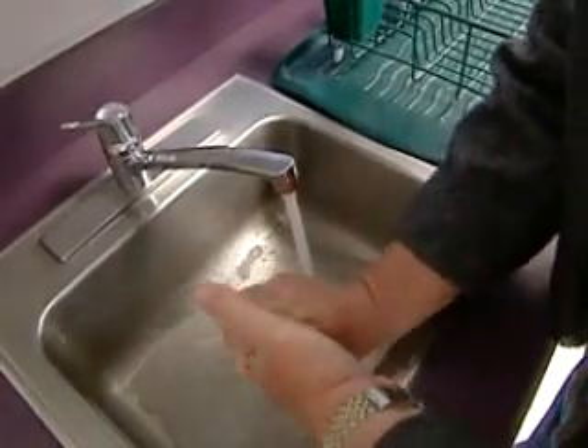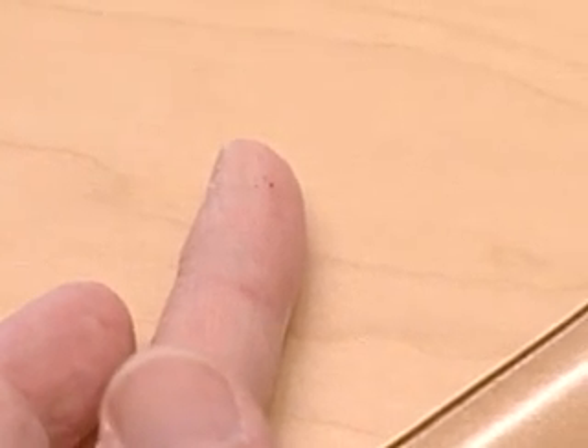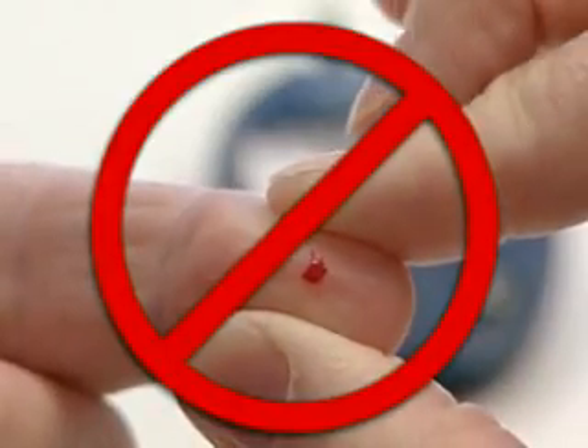Once you're ready to test, wash your hands because even a little bit of food or sugar can affect the results. Make sure the drop of blood is the right size and let the blood flow freely from your finger. Don't squeeze it since that can affect the results.